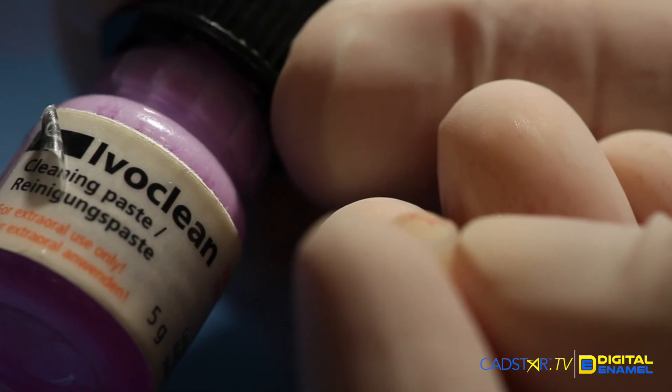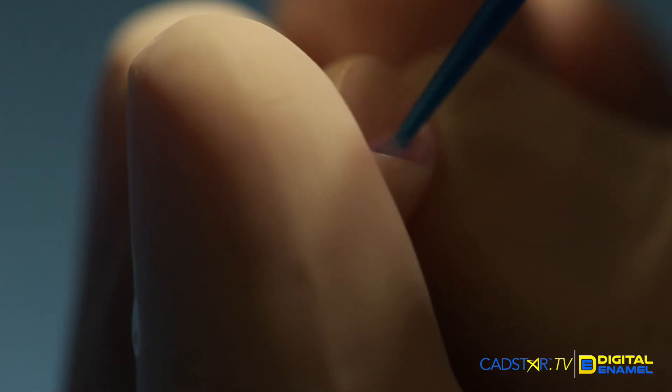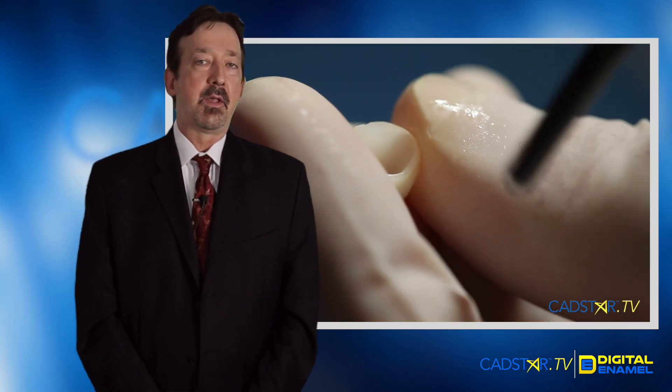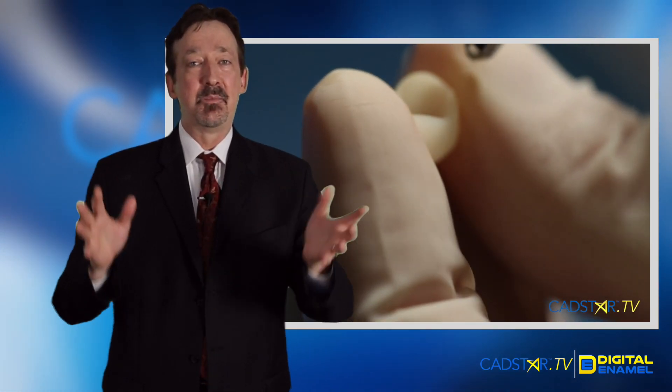Let me go through the steps. Once you try your ceramic in, you'll go ahead and clean your ceramic out. I prefer to use either Ivoclean, steam cleaning, or just a toothbrush. Clean out that saliva — even though the instructions say you don't have to clean out the saliva as long as it's not pooling in there, and the Monobond Etch and Prime will clean it for you. Let's keep our system really clean as we go through this process.